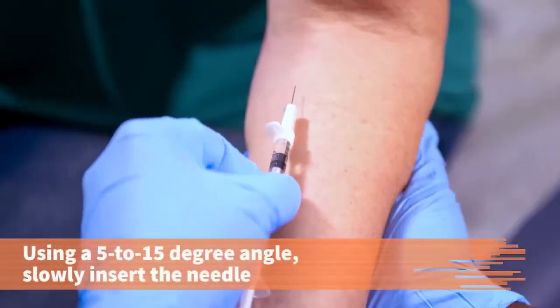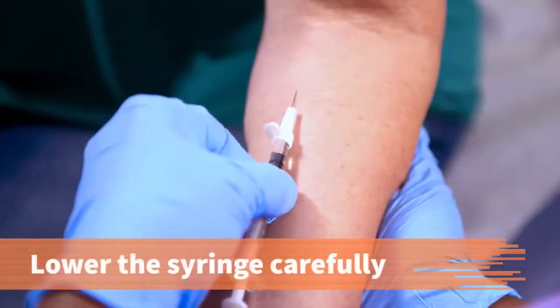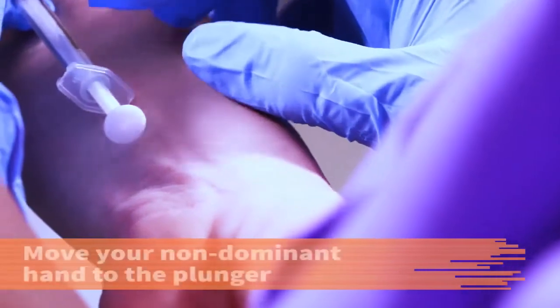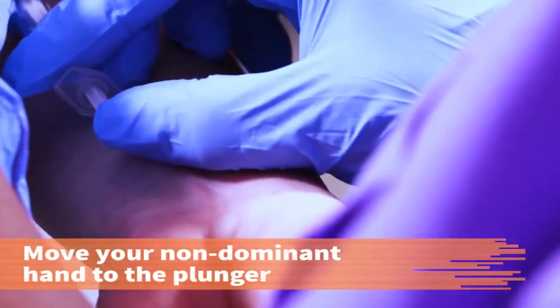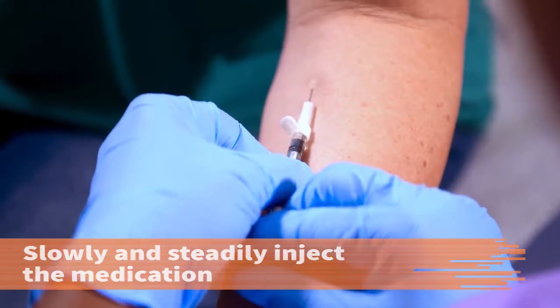With the bevel up and using a 5 to 15 degree angle, slowly insert the needle until the bevel is covered with skin. Carefully lower the syringe to the skin and hold it steady with your dominant hand. Move your non-dominant hand to the plunger. Slowly and steadily inject the medication by pressing on the plunger.